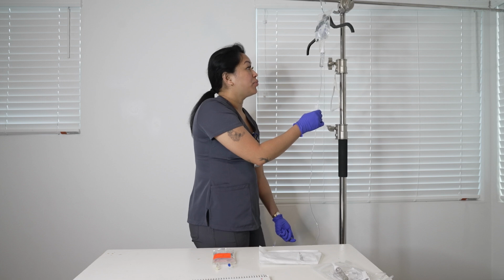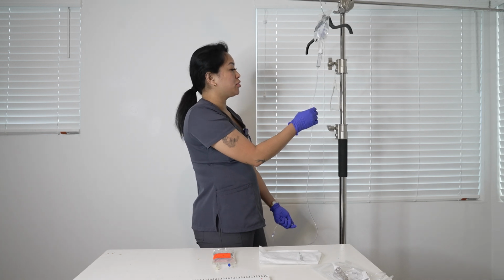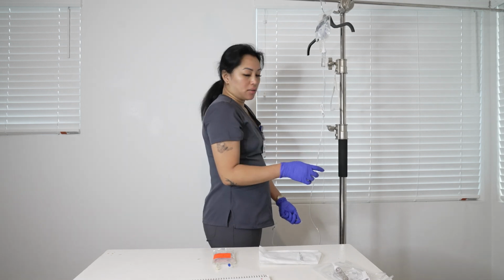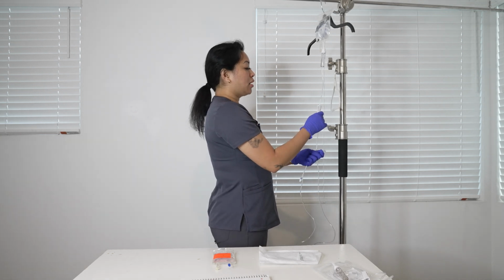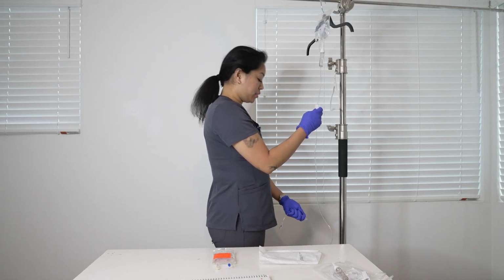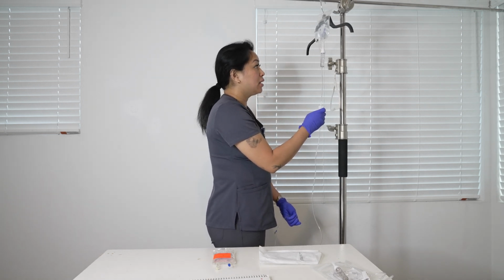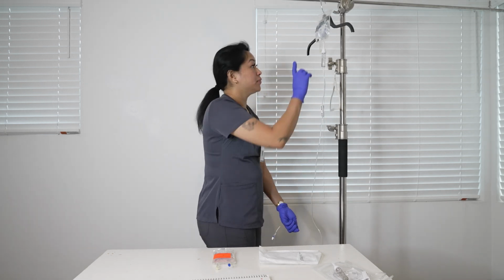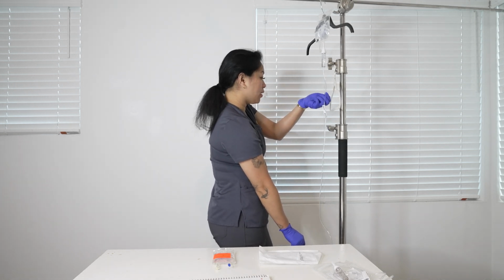So now that I have primed my tubing, there are no air bubbles. Now, since we know that our fluid has to be at 38 drops per minute, I can slowly unclamp the roller clamp, and I will count the drops here in the chamber for a whole minute, starting now.